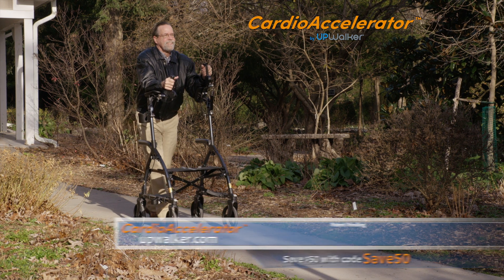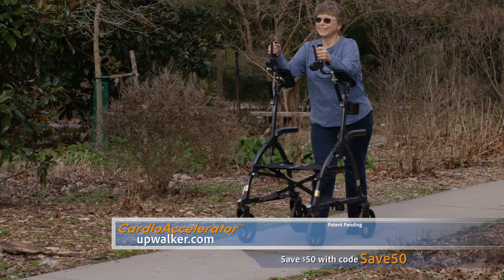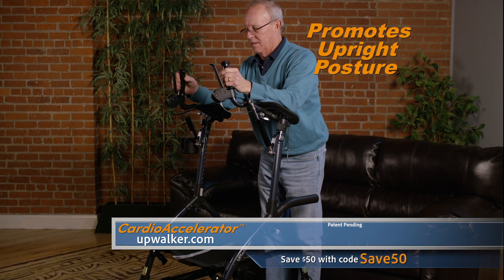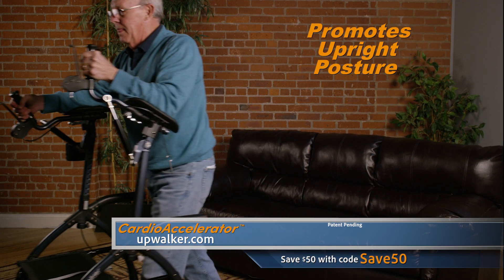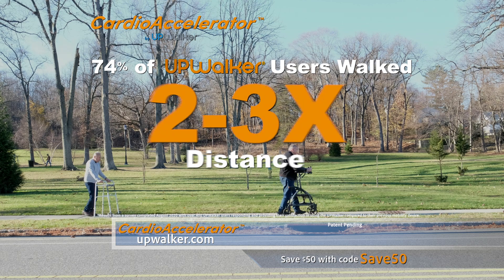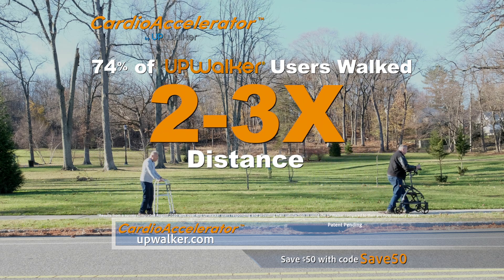From the creators of the original UpWalker comes the revolutionary Cardio Accelerator, an exciting new way for seniors to exercise and regain their mobility. The Cardio Accelerator promotes an upright posture, which boosts oxygen flow and increases energy levels. In fact, a recent survey found that 74% of UpWalker users were able to walk two to three times further compared to use of their previous mobility device.